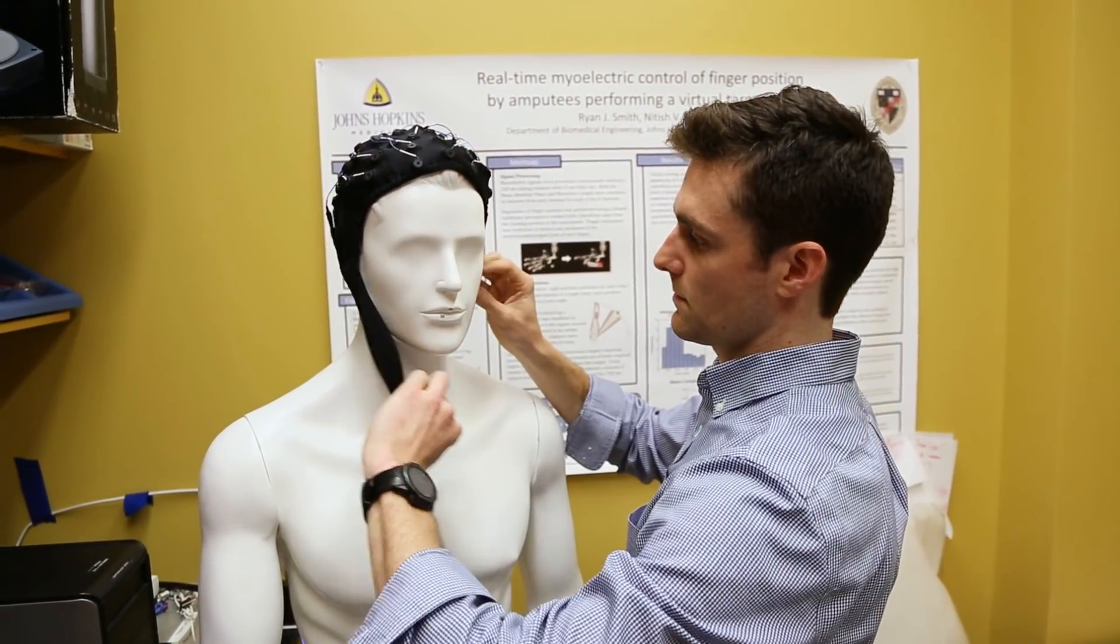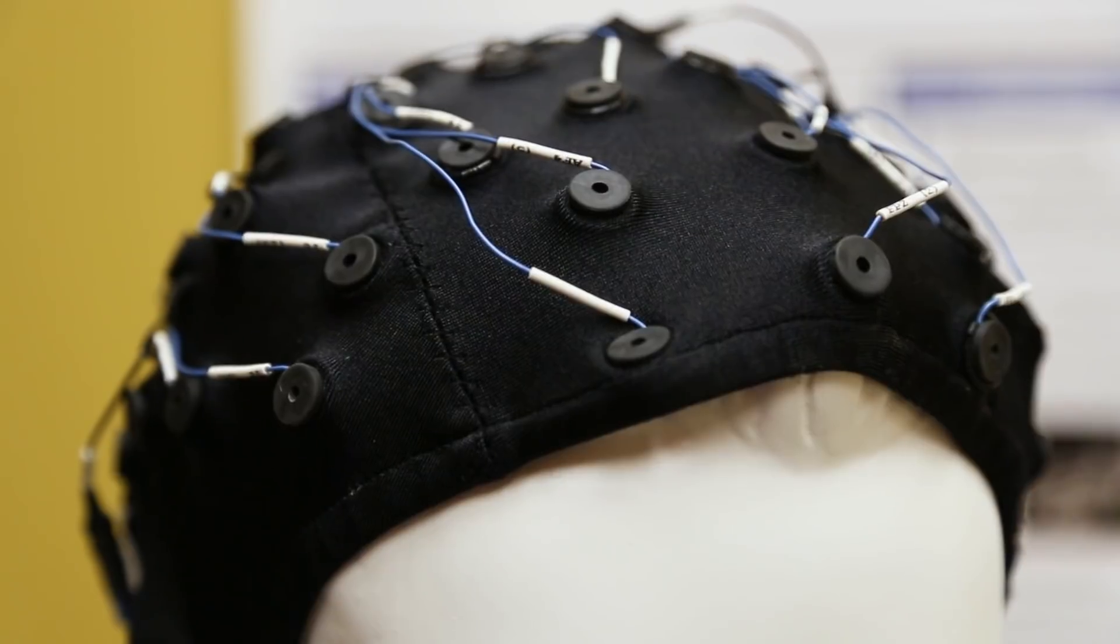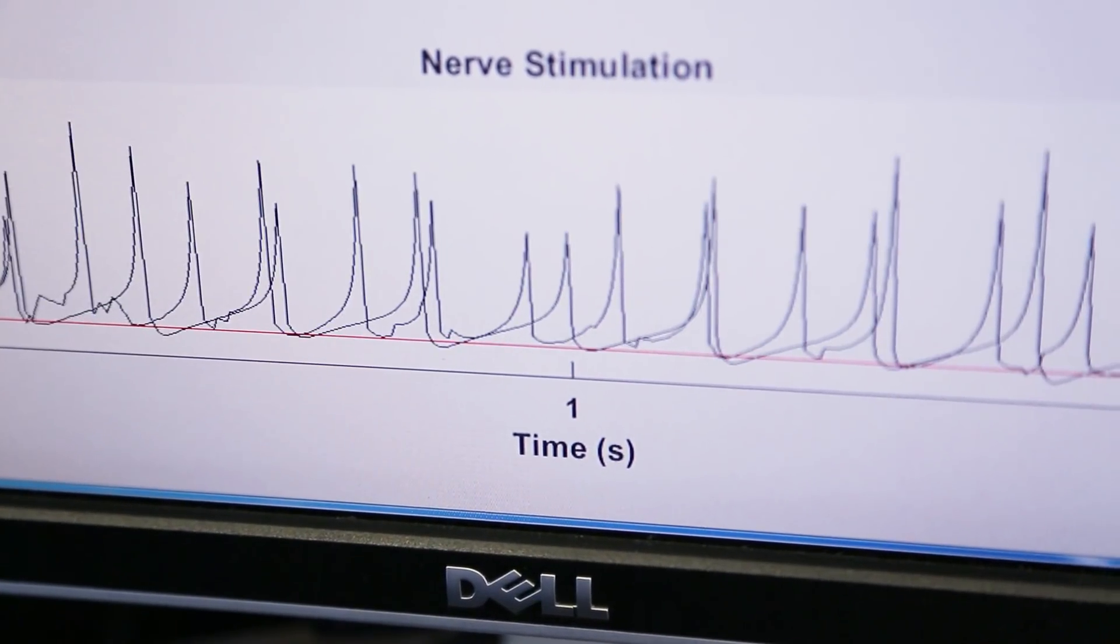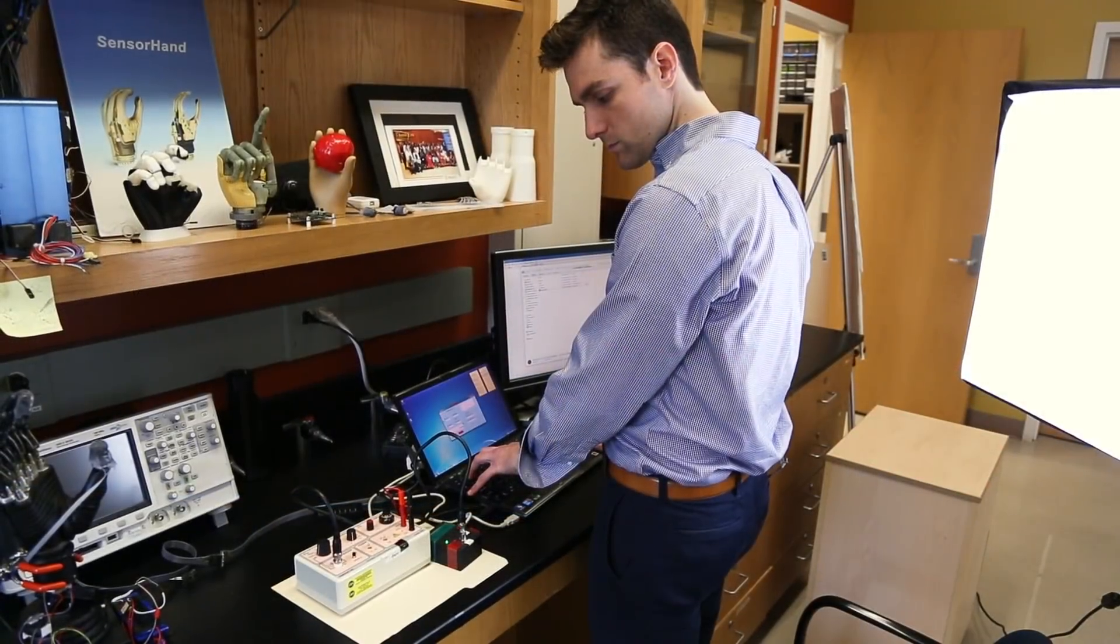With the sensory feedback, we can provide natural sensations to the phantom hand of an amputee, and this is really important because it's taking one more step closer to having a lifelike upper limb prosthesis.